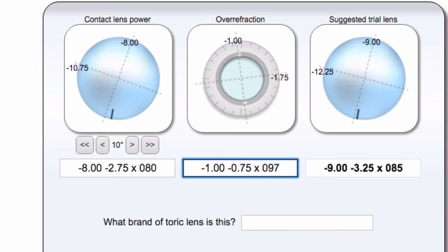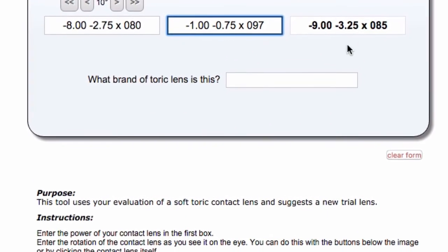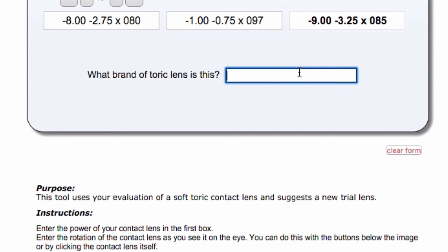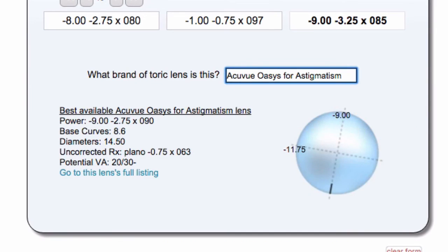For example, once you get these numbers, you look at them and say, well, this is axis 85, most contacts don't come in axis 85, they come in 80 or 90, and the cylinder power is 3.25. I know that my contacts don't come in that high of cylinder power. So what you can do is you can type in what contact lens you had on the patient's eye. For example, if it was an Acuvue Oasys for Astigmatism, you can just type in that and hit enter, and it'll tell you what the closest lens that is available to this ideal contact lens.